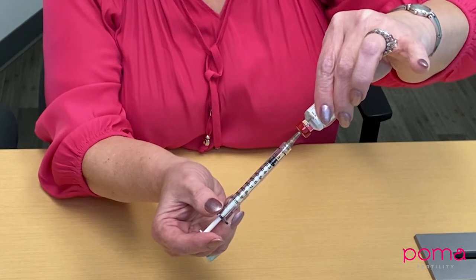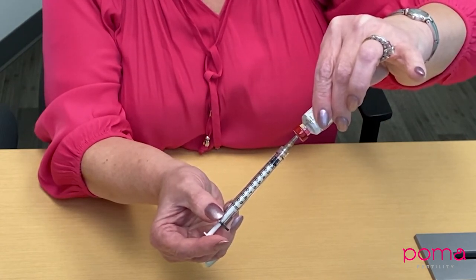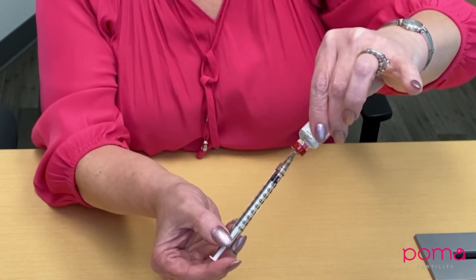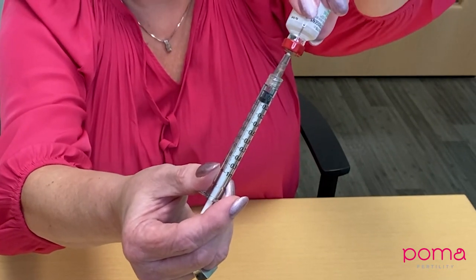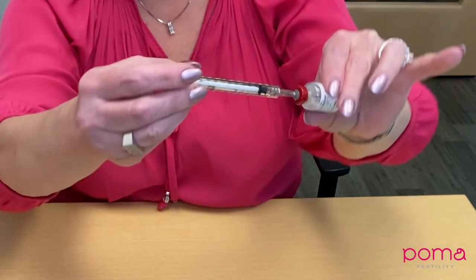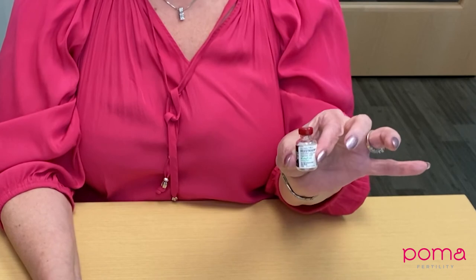For your first dose of Delestrogen, you're going to go to a dose of 0.05 — this is the medium mark between 0.1 and 0. Look very carefully, as this is a very small amount of medication. Now take your medication out of the vial.